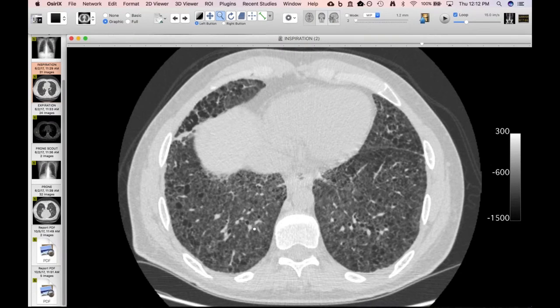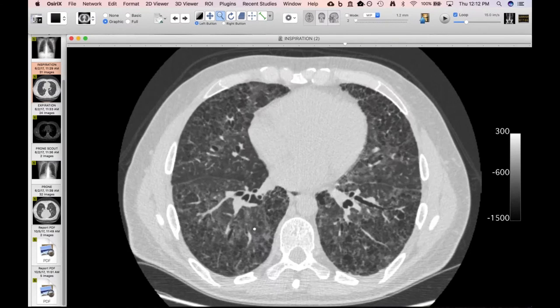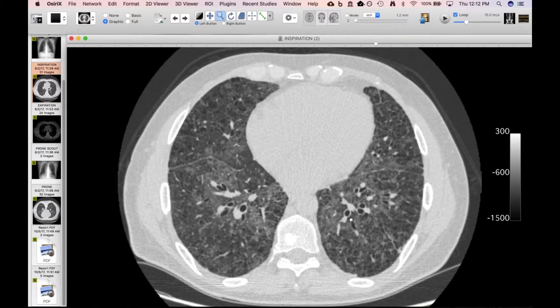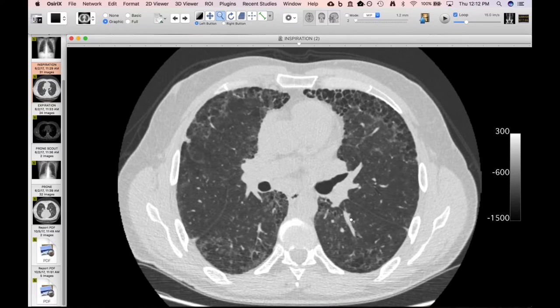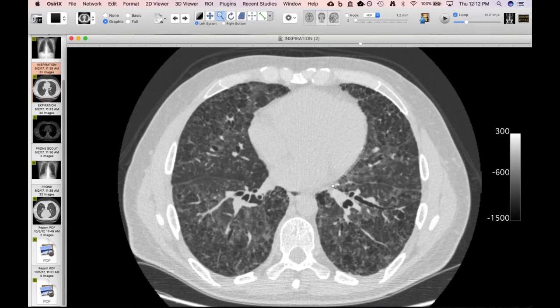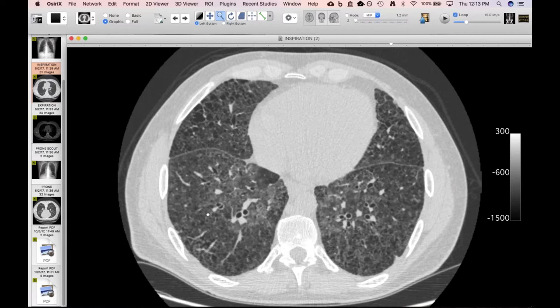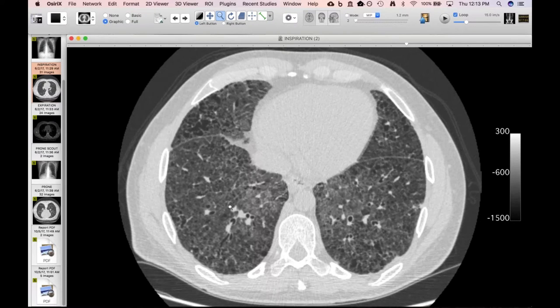Yeah. It's something else, because if you look at the lungs, they are diffusely gray, number one. And of course, in the lower lung zones, they're even grayer or ground glass, so the lungs diffusely are abnormal, whereas with the usual UIP, between the abnormal regions, the lungs generally look okay. Sure, right. It's that spatial heterogeneity, whereas this is much more spatially homogeneous. So if you're going by ATS guidelines, you say A, that there's diffuse ground glass, which makes it inconsistent with UIP, and B, it's a peribronchovascular distribution, at least in the lower lobes.